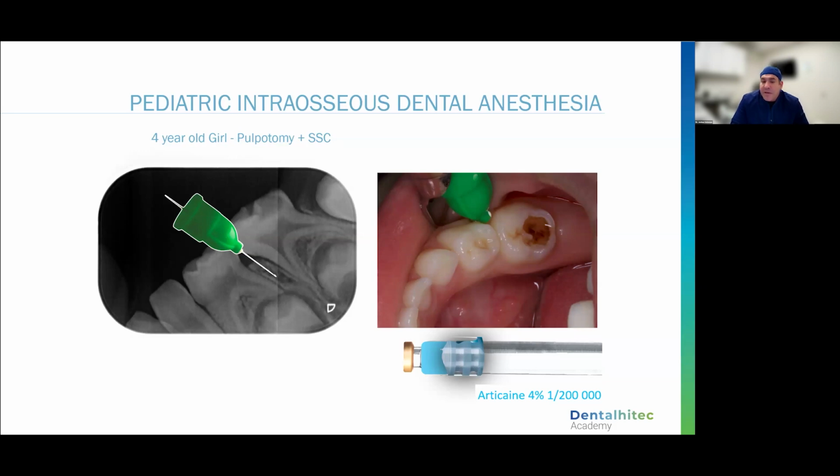All right. The other thing I want you to remember is you don't always have to go from the buccal. If I have a patient that I need to, and I'm right-handed, if I need to give local anesthesia for the upper left-hand side for I and J, I may give this palatally. You can absolutely do the same exact steps with a palatal injection. Now, most of us are not used to giving palatal. I tell you, the first time I gave a palatal injection in many years was only with a Sleeper One or SOAN. Remember, on the palate, you only have 2 roots to deal with on 2 teeth. You don't have 4 there. So you actually have more room. And if you need to, give it palatally.